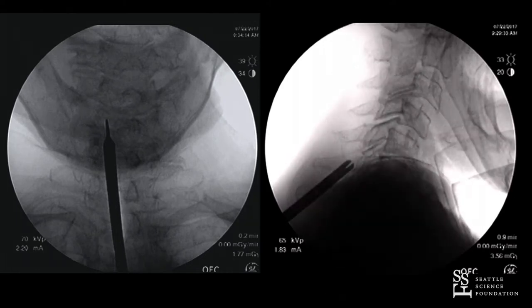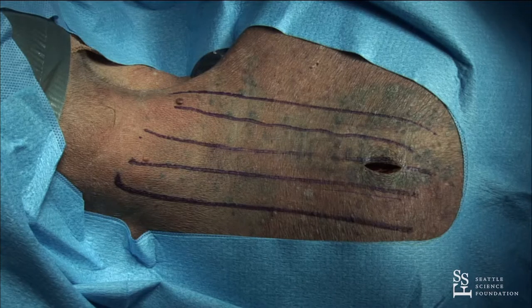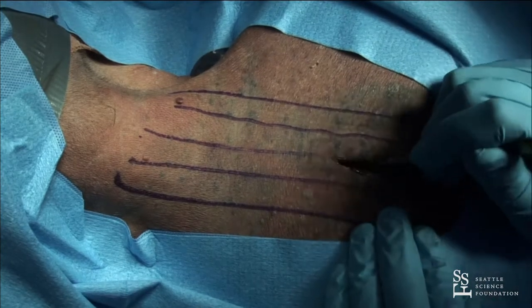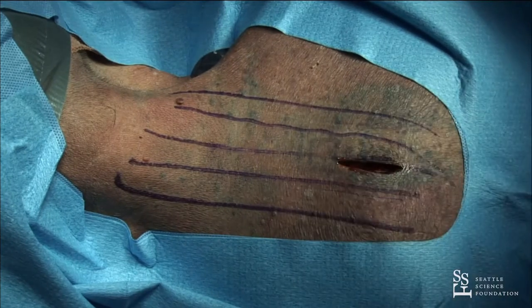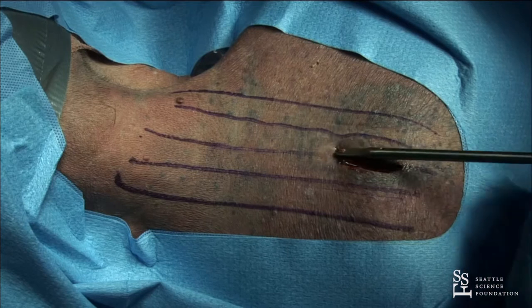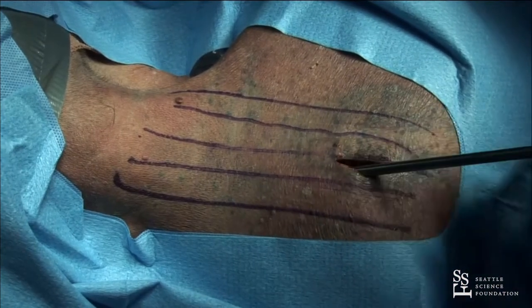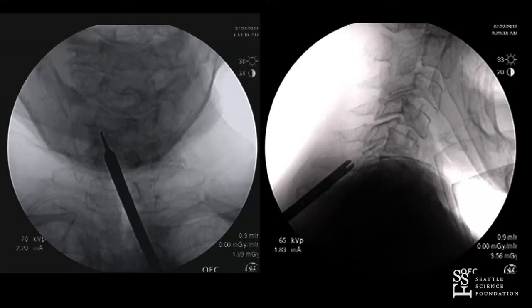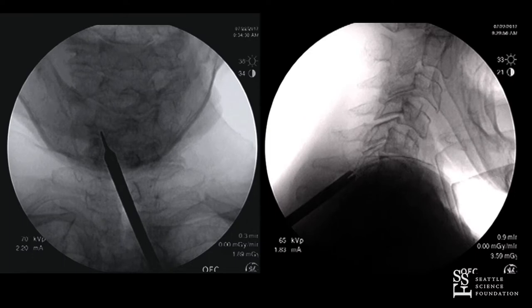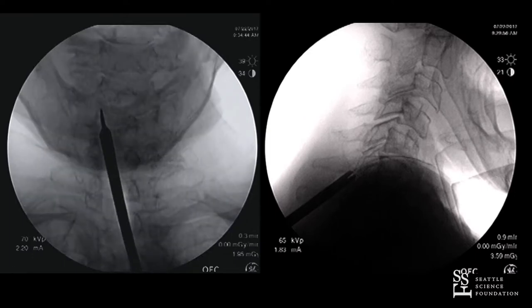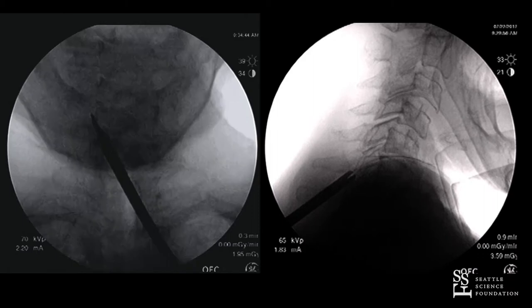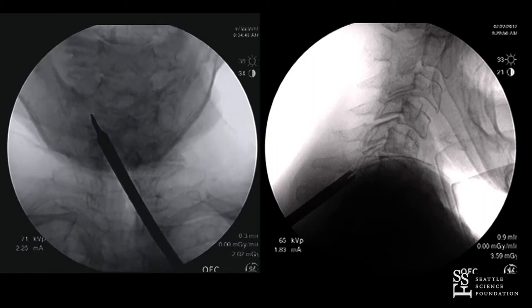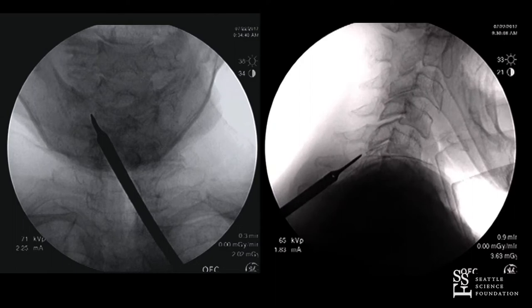May have to make the incision slightly higher up. So I can go a little higher up. What I'm going to do is come down on bone — I want to be on bone over the lateral mass. So that's about — what level am I? Two, three, four, about five, six.